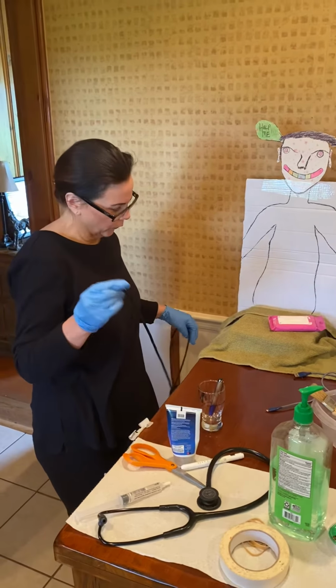So first, we are going to go ahead and lubricate about 2 inches. So this is lubricated. Okay, Mr. Smith, we're gonna get ready to insert this NG tube down your nose. And remember, we are establishing a sign: if you need me to stop at any point, you're just gonna raise your hand, okay? Okay, so we're good to go.